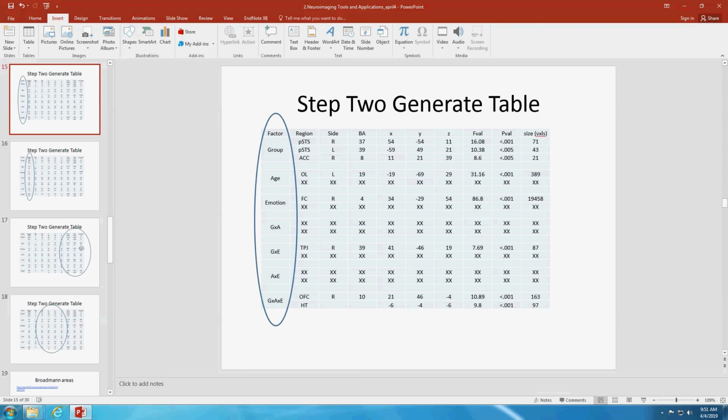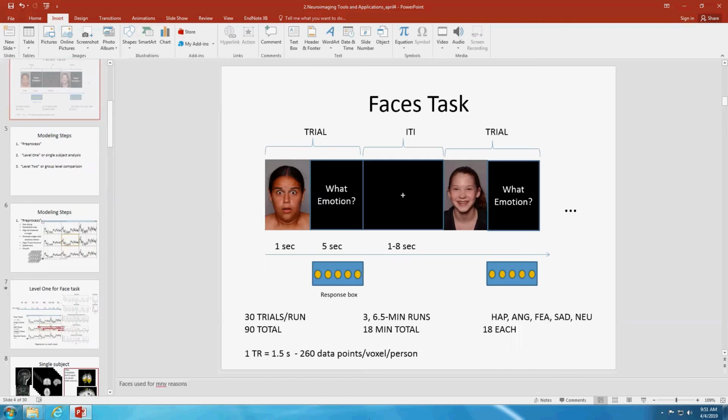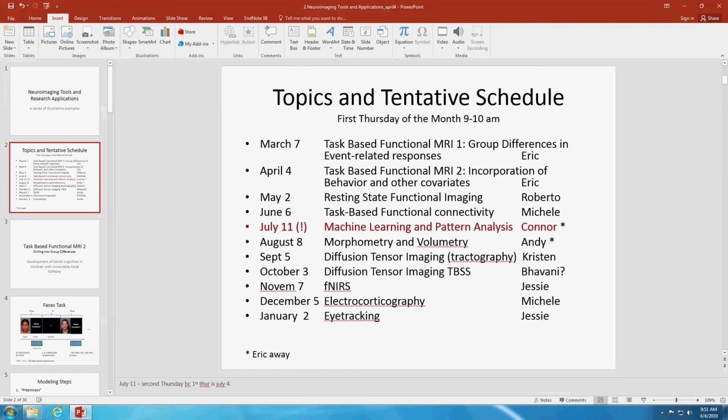And after that, another thing you do in this sort of group level analysis is functional connectivity. That is trying to get at networks. So if you had something like this, looking at an area that's different in these groups, does it connect differently with different areas of the brain? Maybe what's really happening is there's a circuit that involves some area in your frontal cortex, and your amygdala is related broadly. That whole network is down. So looking at how different things relate to that.